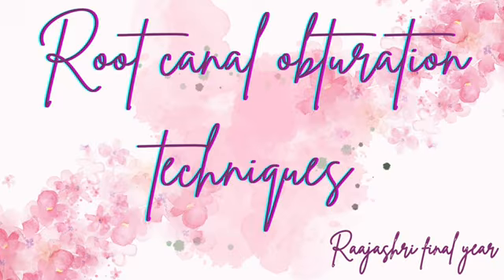Obturation is a process of filling the cleaned and shaped root canal spaces with a biocompatible material in order to prevent reinfection and to create a fluid-tight seal. This step plays a critical role in eliminating the pathways for microorganisms and ensuring the long-term success of the treatment.